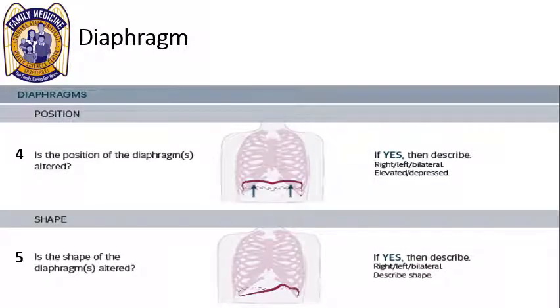So the diaphragm is very important. If you have the diaphragm really high on one side and not the other, well then we're going to have some problems. So we need to be able to identify where that is and make those critical decisions based on the context of the patient. And one thing that you cannot miss is if the diaphragm has black or a hypoopacity underneath it and it's not a gastric bubble. If it's on the right side, then that is a surgical emergency. The patient goes in for an acute abdomen. So air in the abdomen is not normal unless it's in the intestines.